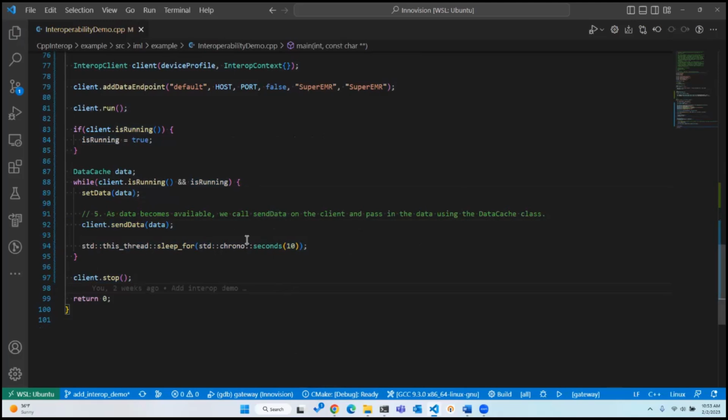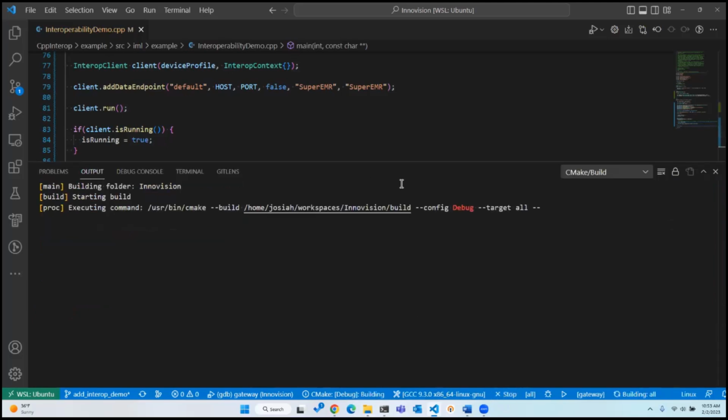So what this represents, essentially, is that as data becomes available to our Acme pulse ox, we're going to send that. Here I'm just saying it's becoming available every 10 seconds. That's just for the purpose of this demo. Okay. So let's actually compile and then run this example.